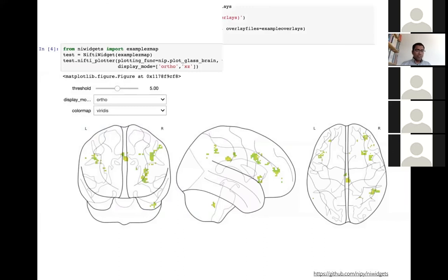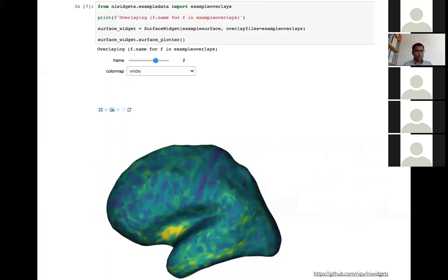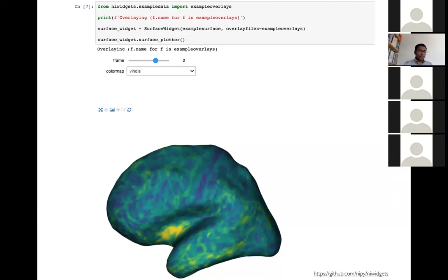You can also use surface mapping — showing a particular overlay on an inflated surface of the brain, where you can interact with things as they're being plotted. You can also look at streamline widgets: things from diffusion MRI, you can look at diffusion pathways represented as streamlines through analytical processing. This is an interactive tool where you can control thresholds on lengths of pathways.